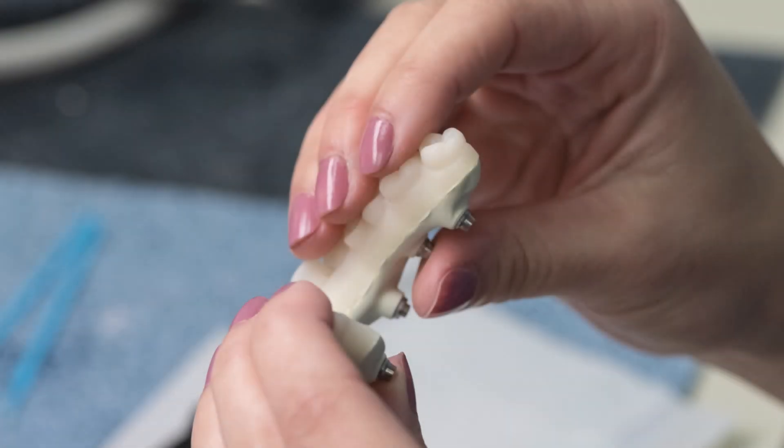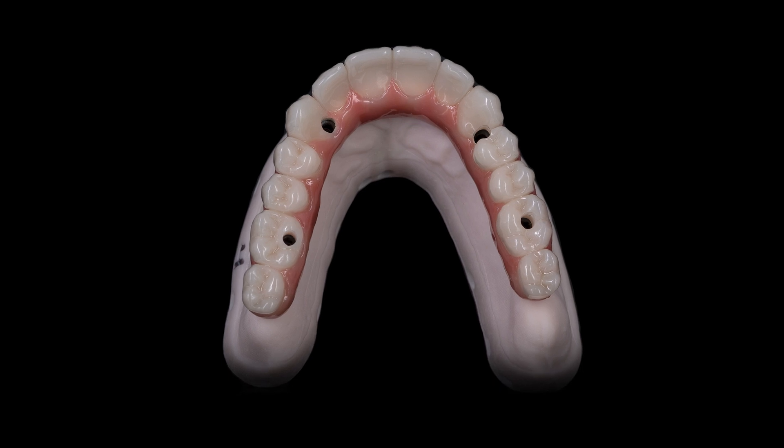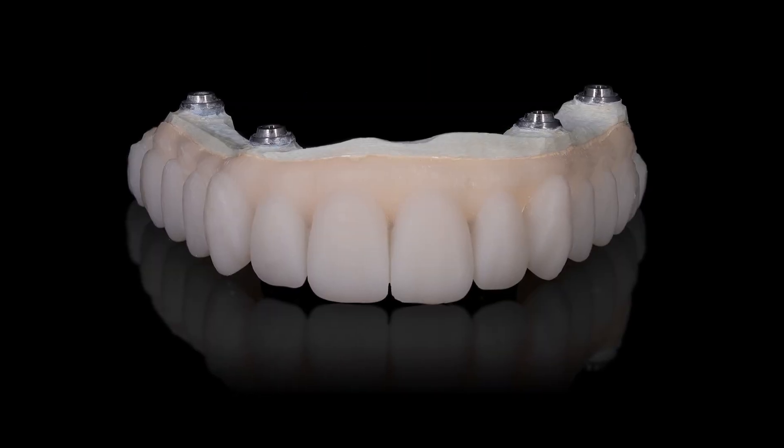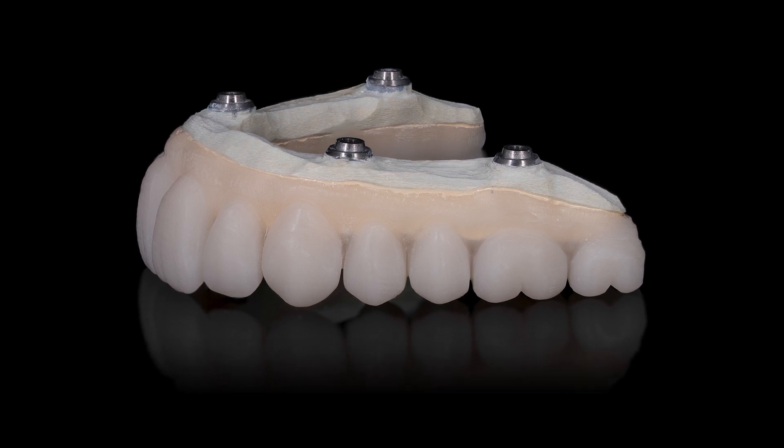Trilor exhibits natural flex and load parameters, making it the ideal replacement for unforgiving metal and zirconia frameworks. We use Trilor as the substructure for our screw retained crystal ultra hybrids. This not only reduces the overall weight compared to zirconia hybrids, but also greatly improves the overall strength. Trilor exhibits natural flex.